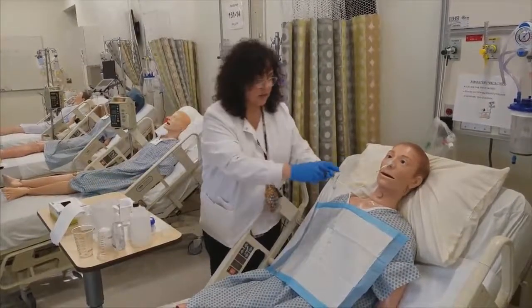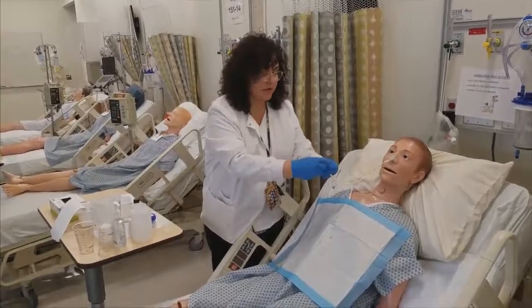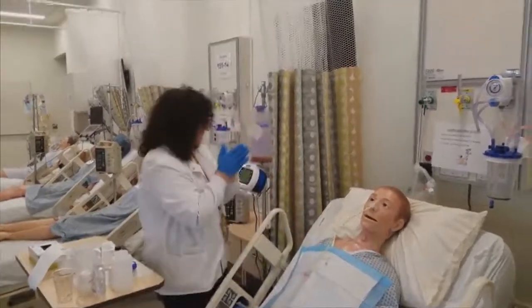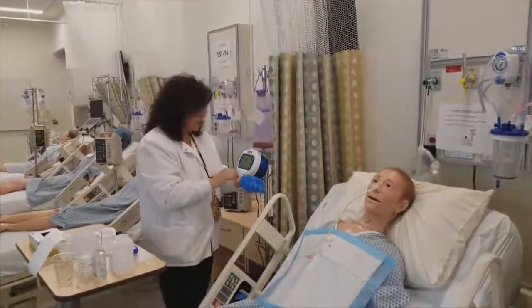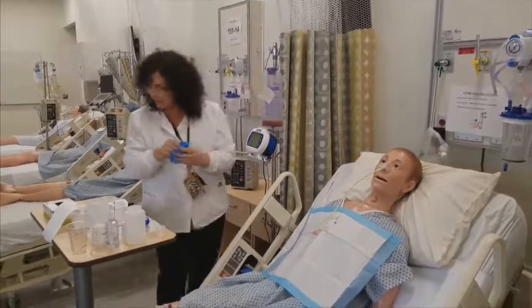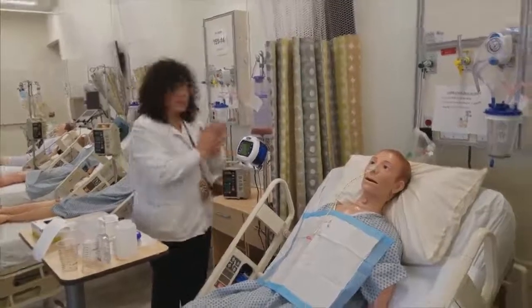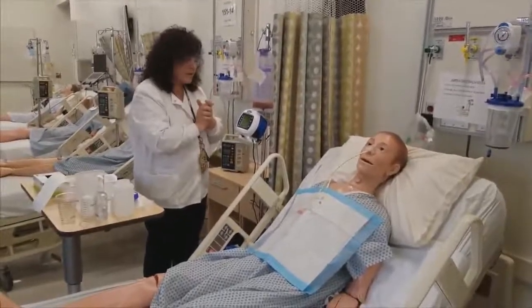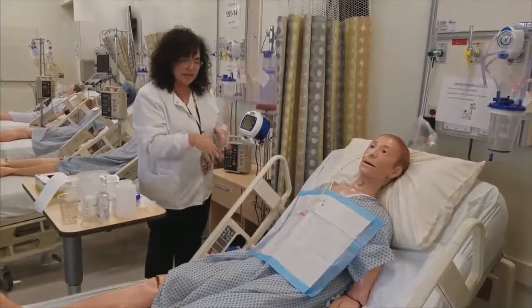And then I have to think about this tube feeding here. Now that my meds are in and everything is flushed, remember my protocol. I'm going to increase by 10 based on tolerance. I know that my GRV is low. That's a good thing. Patient's not distended.